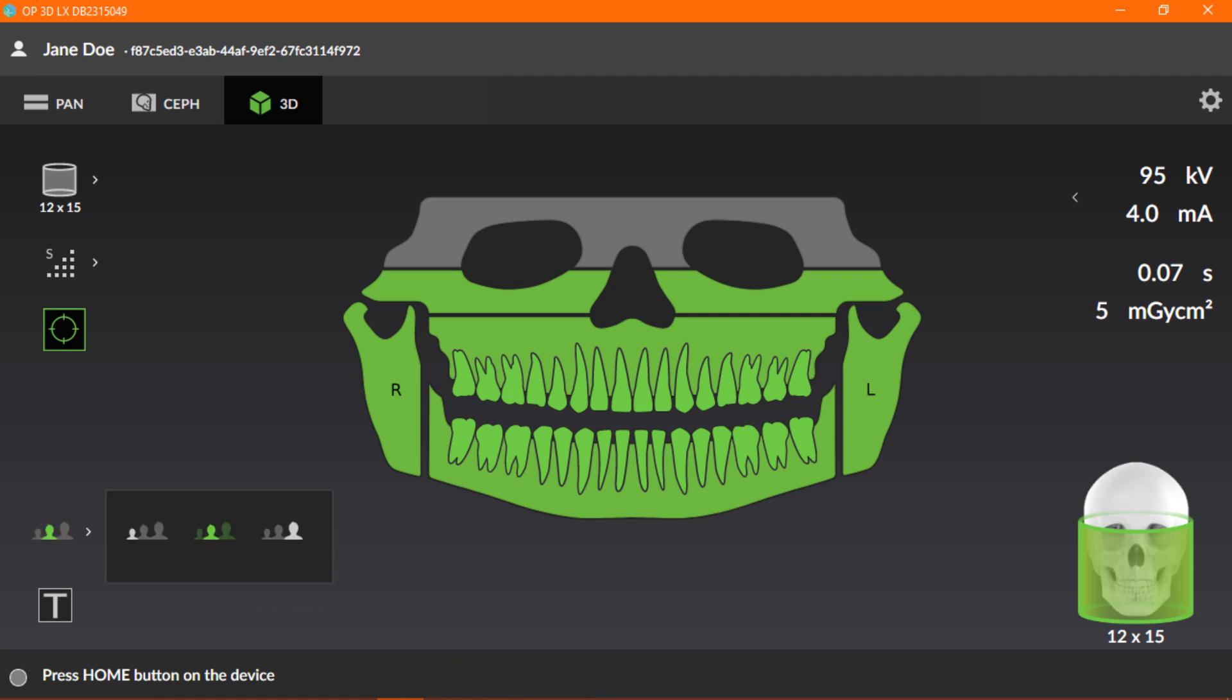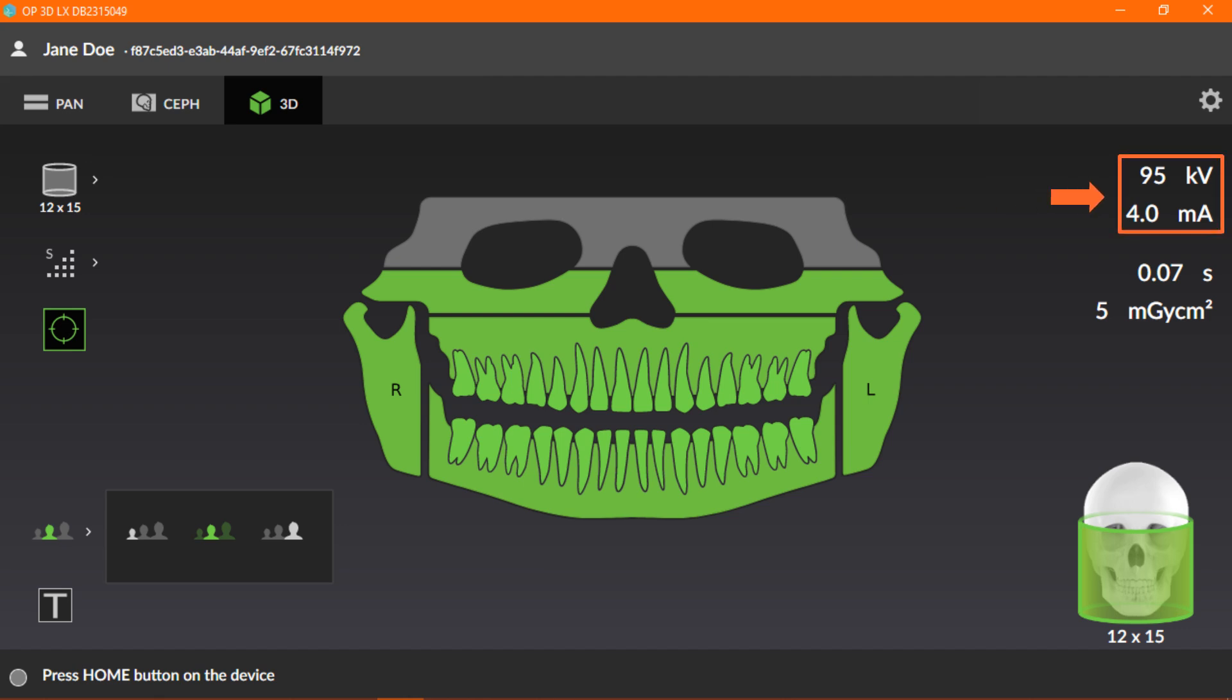The available sizes are small, medium, and large. This selection should be made based on the patient size, and the KV and MA preset levels will adjust accordingly. For this example, we'll use the medium patient size selection.